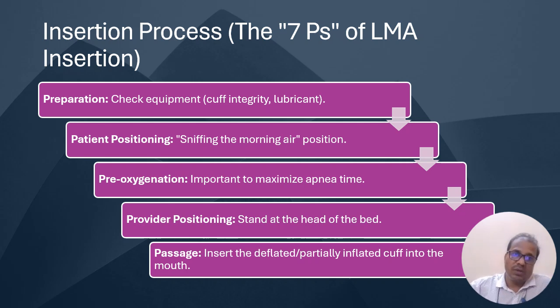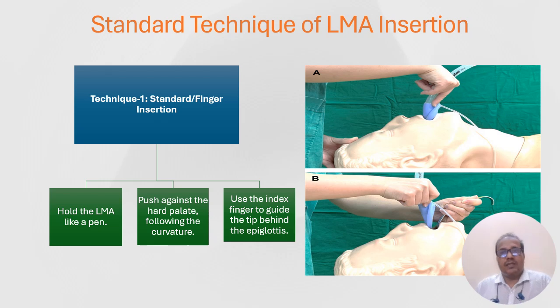And pre-oxygenation is done to prevent hypoxia during the insertion time. We will never pass an inflated cuffed LMA. We can insert a partially or fully deflated cuffed LMA. And this is the standard technique we usually use for LMA insertion.